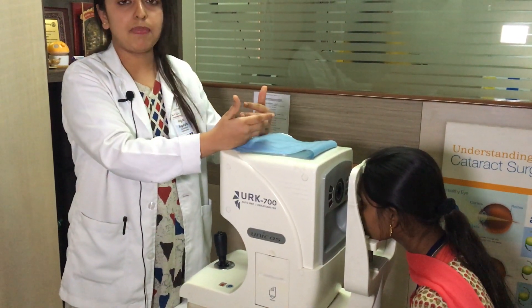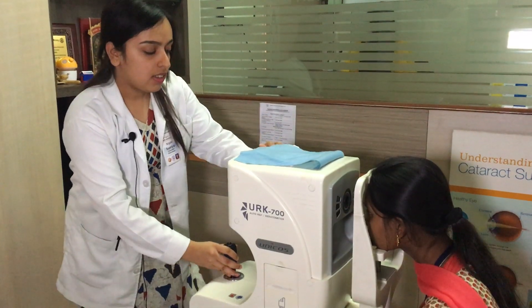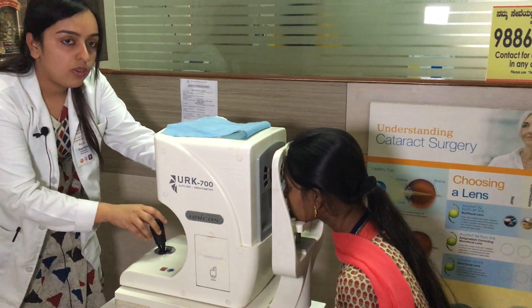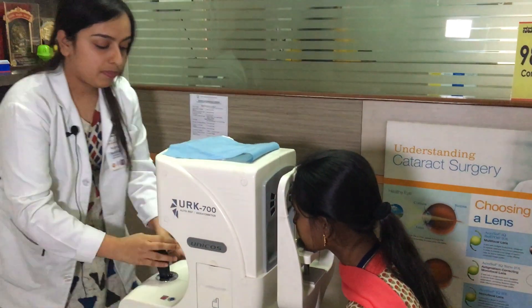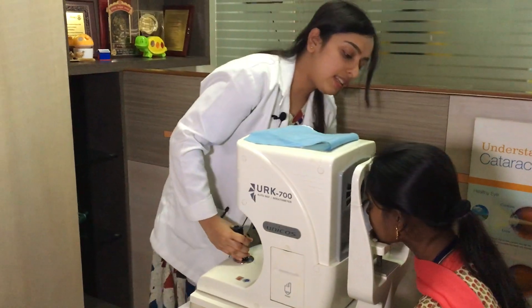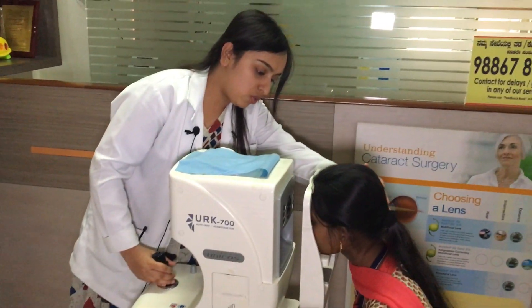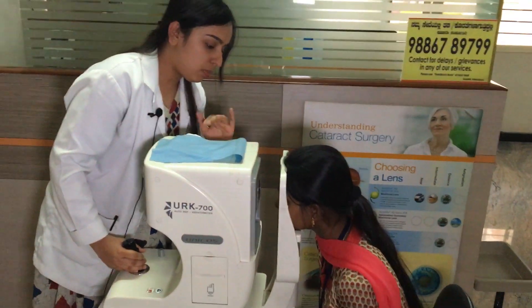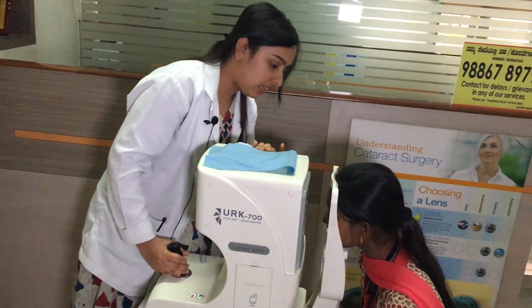If we focus on this distance, the pressure will be reduced. By focusing on this distance, the muscles are relaxed and we can get an accurate reading. The concentration must be straight at the distance.